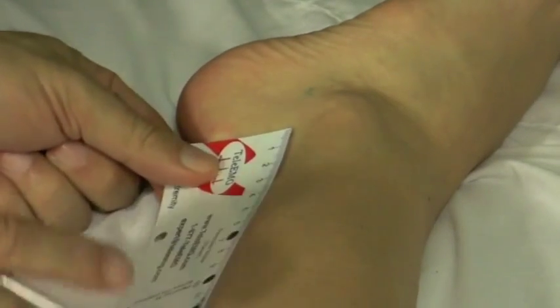And I measure 14 centimeters from the active electrode up to the calf. And this is marked here, 14 centimeters for sural nerve. So I mark up the spot where I'm going to stimulate the sural nerve.